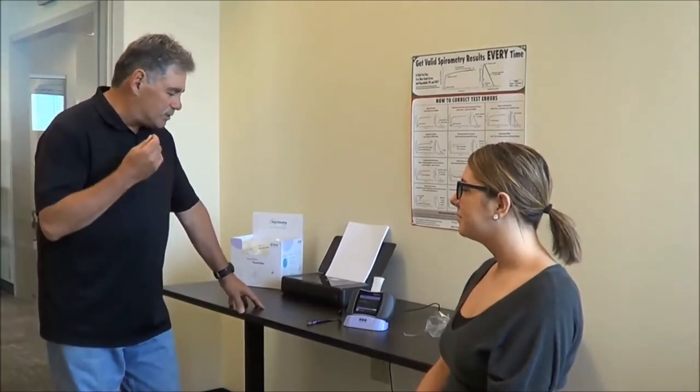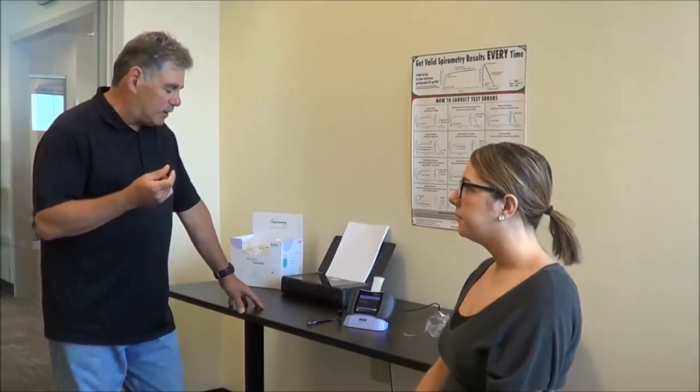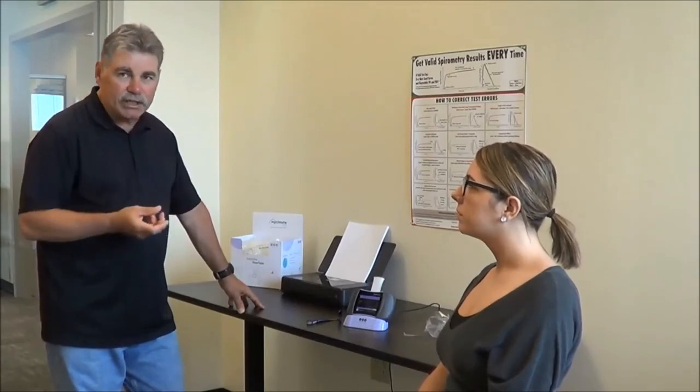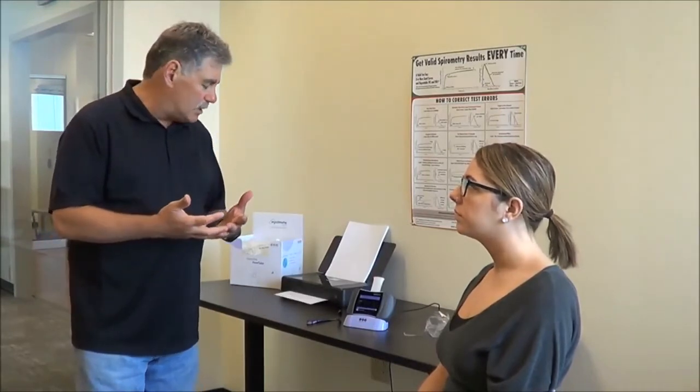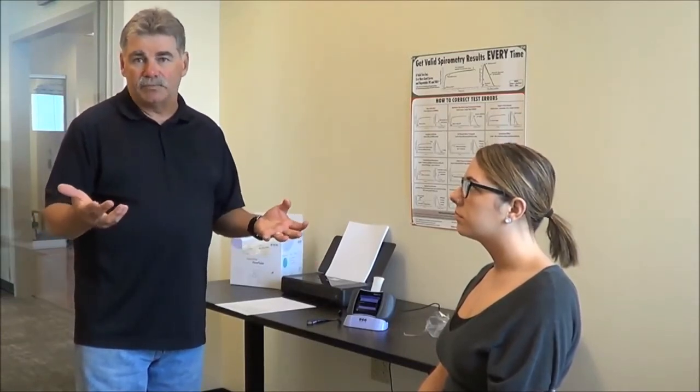Now, also in spirometry, what's common is to do a post-med test, meaning that if I suspect an obstruction, I could administer a bronchodilator to the patient, have them wait 10 or 15 minutes, depending on the drug, and have them repeat the test on a post-trial basis, and then I would be able to compare how well the drug affected her measurements, and therefore be able to diagnose possible asthma.